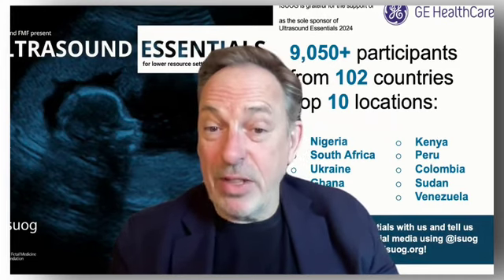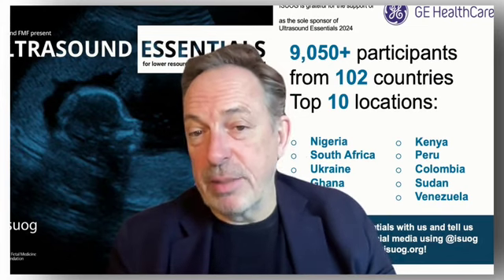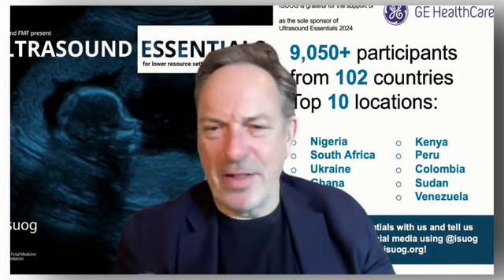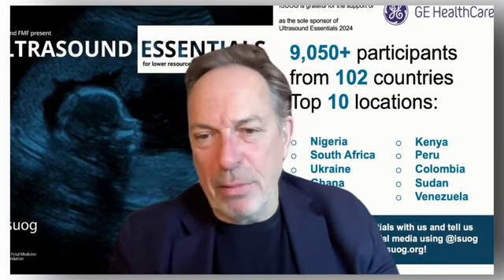So I agree, it's important first of all to assess the parametria in normal patients, and then we can assess them, for example, in patients with endometriosis or cervical cancer. Yes, because if you know what normal looks like, sometimes it's not normal. You might not know exactly what's happening, but you recognize it as being abnormal. Exactly. It's a bit like when you start doing obstetric scanning and you know the normal planes, and then it's like, I don't know what that is, but I know that isn't normal. I think that is a helpful thing to do.